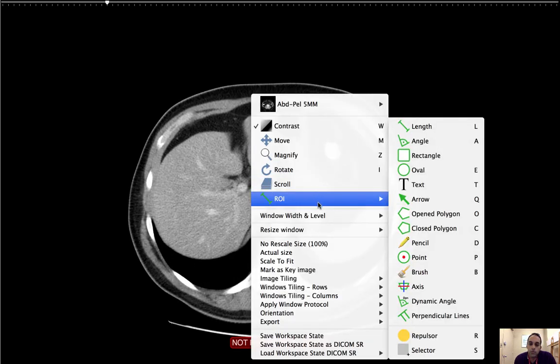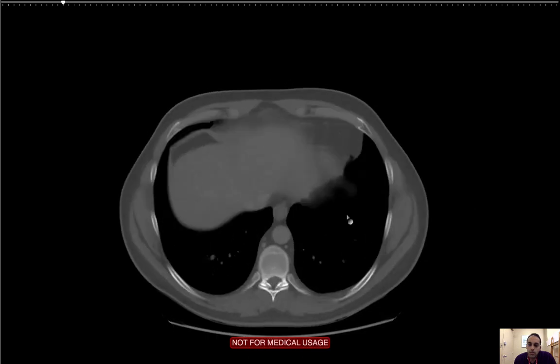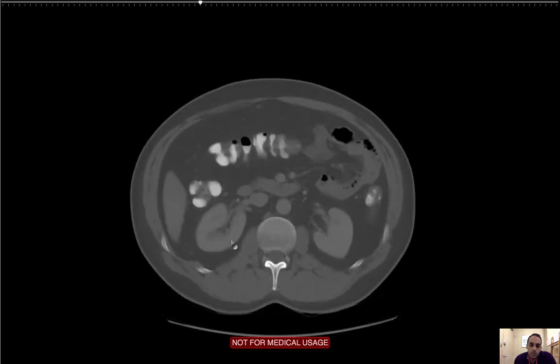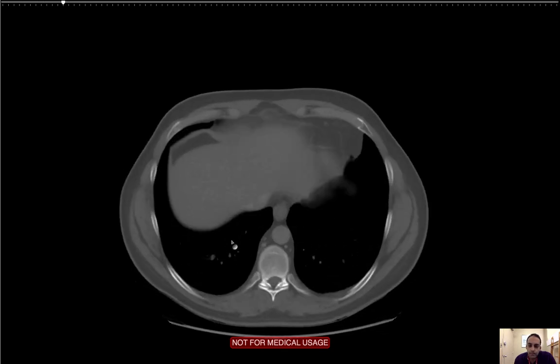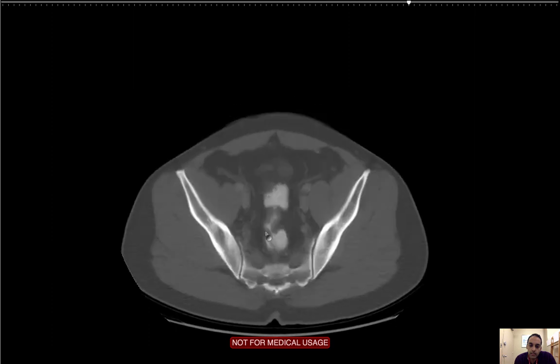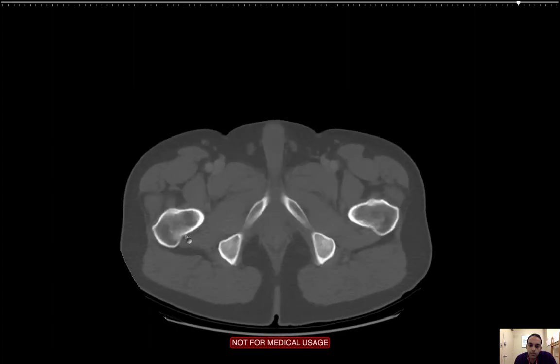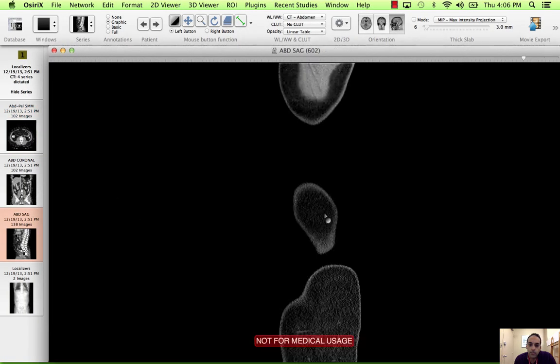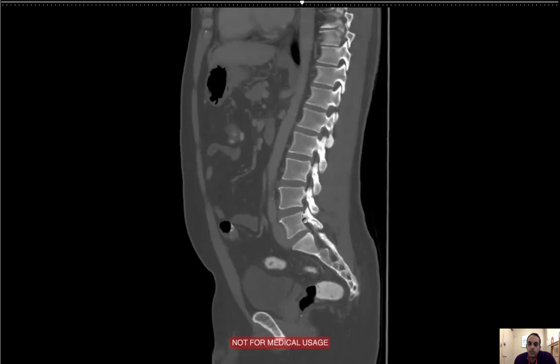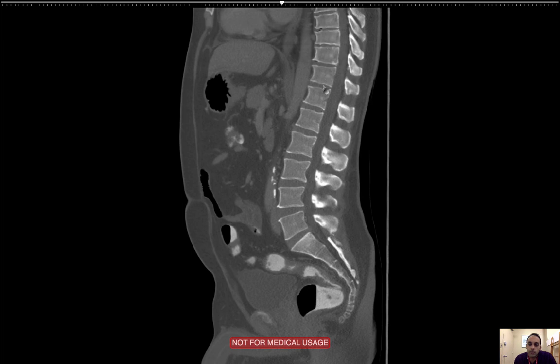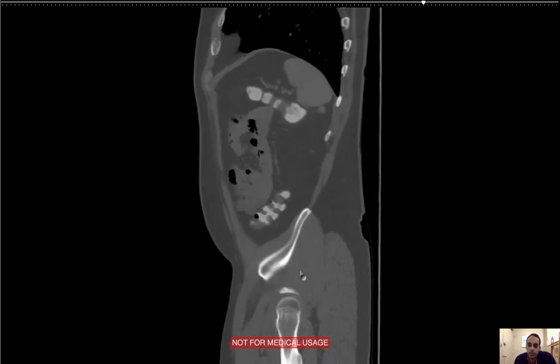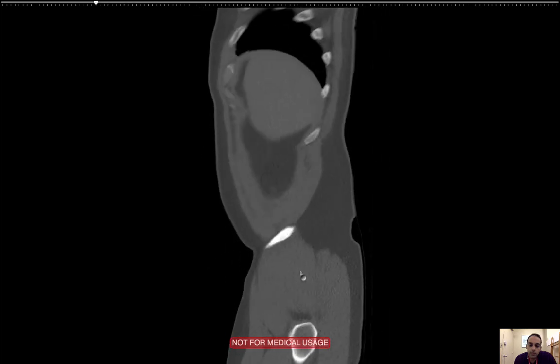Switching windows, I'm looking at the bones. Starting with the ribs on the left, then the ribs on the right — looking for any focal lesions, sclerotic lesions, or lucent lesions. In the setting of trauma I'd be looking for fractures. I'm looking at the spinal column, the pelvic bones, and the proximal femurs. I'm not seeing any fractures, abnormalities, or focal lesions. On the sagittal plane, the spine is shown nicely — no compression deformity, nice normal alignment. I also flip over to see each hip joint in the sagittal plane to make sure I'm not missing any fractures.